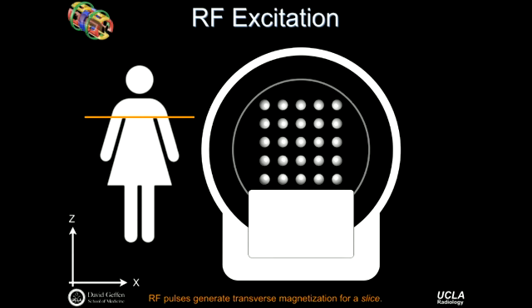This is the process of excitation inside the scanner. This will animate in just a second. So what we're doing right now is looking down the bore of the scanner. This patient, oh look, it is moving. Okay, let's back this up just a second.